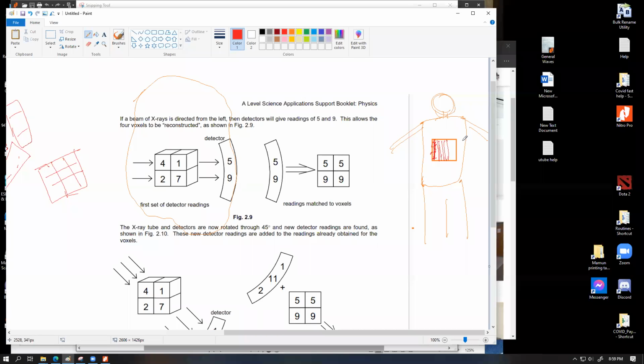So the value of an individual slice is calculated by a process which is shown over here. This process that we have shown, the multiple addition and eventually subtraction, background intensity subtraction, and dividing by 3, has to be done for all the individual slices side by side to get the voxel values of all of those voxels.